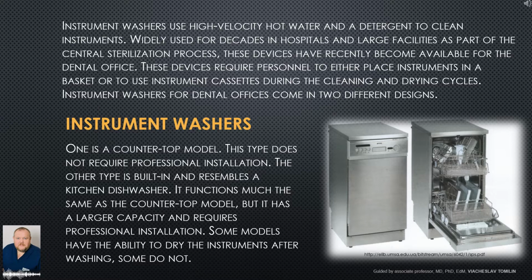Instrument washers use high-velocity hot water and a detergent to clean instruments. Widely used for decades in hospitals and large facilities as part of the central sterilization process, these devices have recently become available for the dental office. These devices require personnel to either place instruments in a basket or to use instrument cassettes during the cleaning and drying cycles. Instrument washers for dental offices come in 2 different designs.